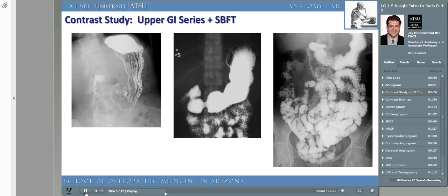Here on the left, we can see the stomach and a portion of the duodenum. On the far right, we see an upper GI series with a small bowel follow-through, abbreviated SBFT. In the middle image, an upper GI is demonstrated with not only the stomach and duodenum being seen, but the proximal portions of the small intestine, notably the jejunum.